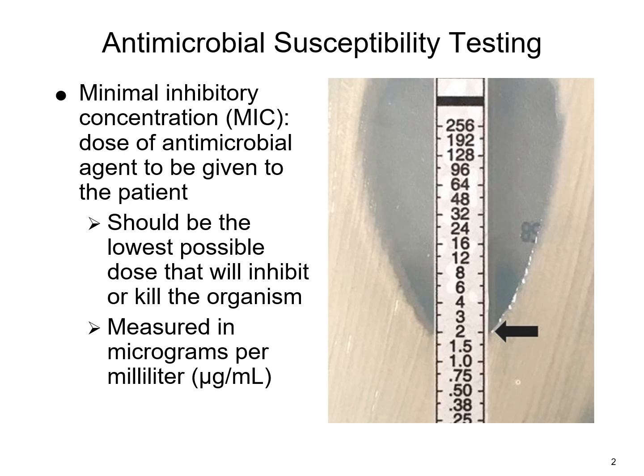You can see where the growth pattern starts right in that area somewhere. The stronger dose is back here, where you've got more antibiotic, whereas you have less antibiotic down here at the bottom.